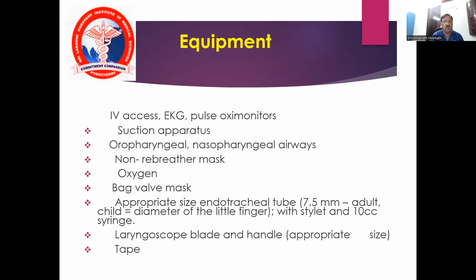What are the equipments required? It is essential to have intravenous access.